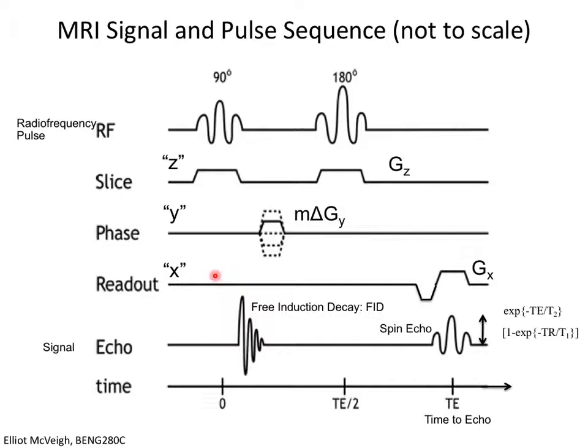It's very useful, because if you want to slice through the heart in an oblique orientation, such that you are in the natural coordinates of the heart, say we want a short axis view, I can pulse the three gradients with relative amplitudes to achieve that oblique slice.